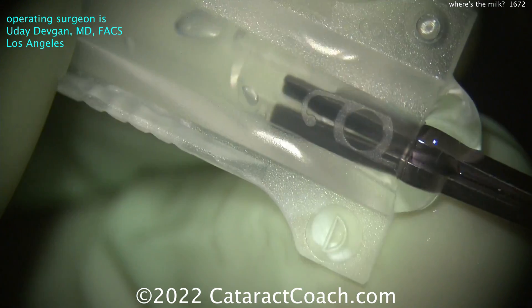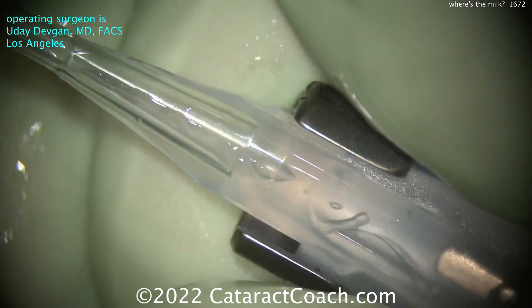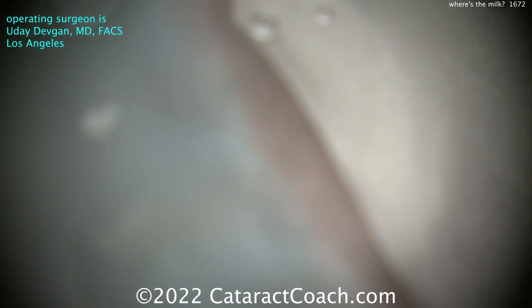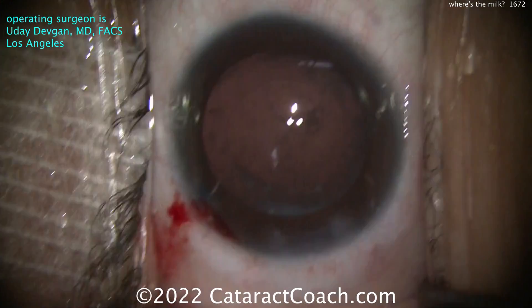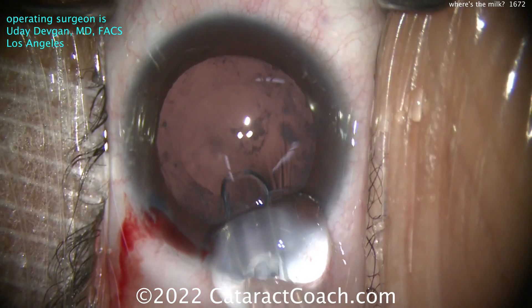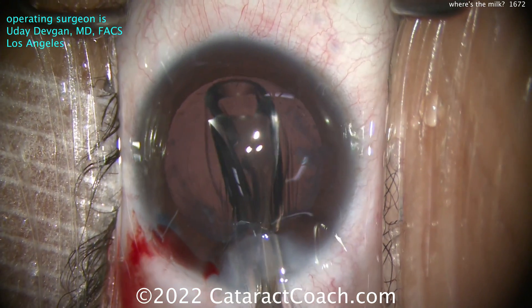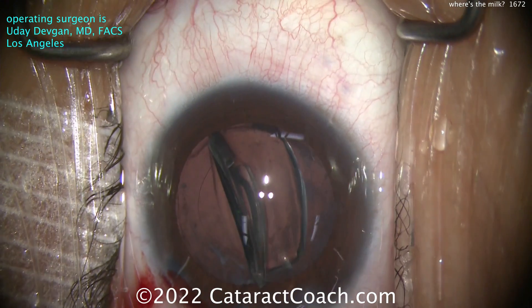Getting that haptic over - these are those special Greishaber forceps provided by the manufacturer specifically for this lens, so it won't mark up the lens. It helps to push the lens down the barrel of the cartridge. Now engaging in the injector, let's start delivering this thing. Surprised to see me loading my own lens? Here comes the lens - we'll get it inside the eye.